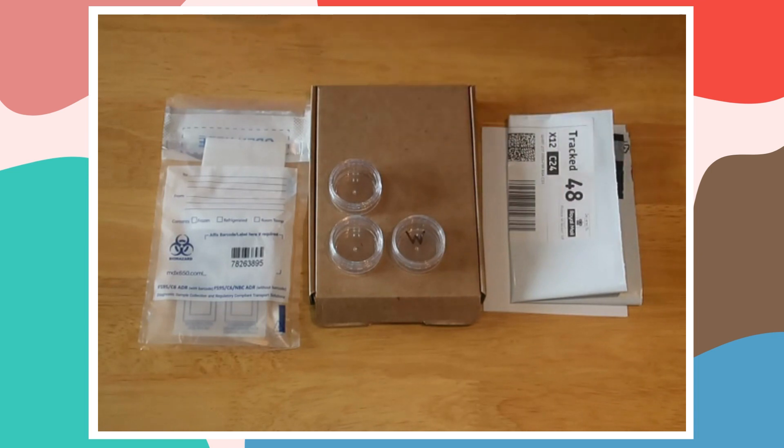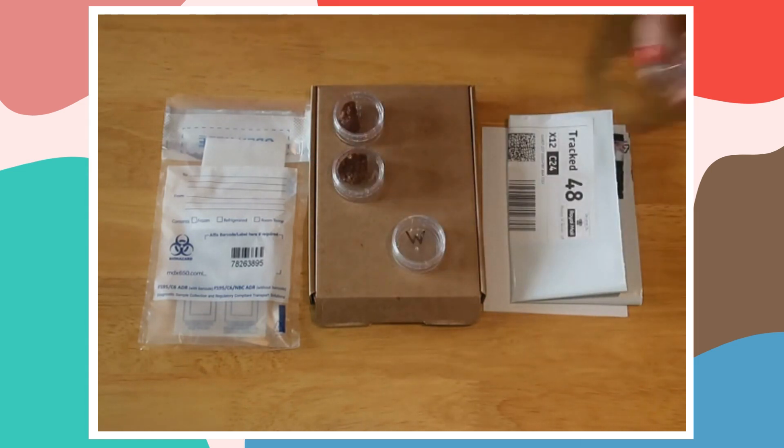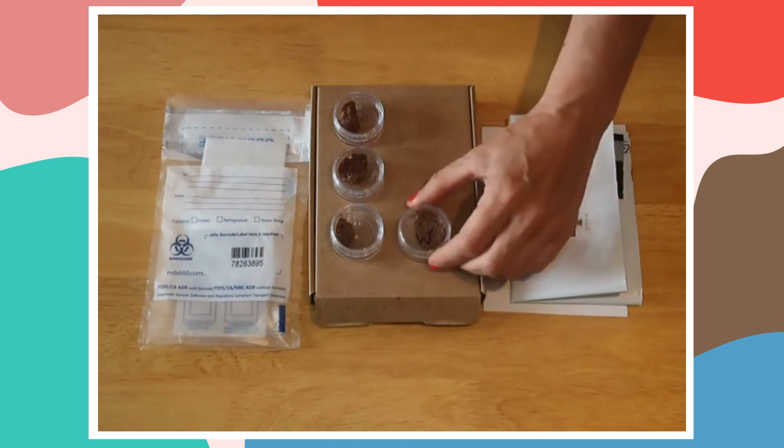So here's one we did earlier: a Monday sample, a Tuesday sample, and a Wednesday sample — and on Wednesday you also do the lung worm test.